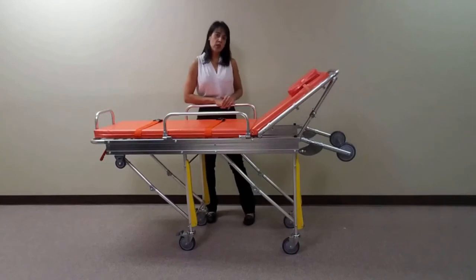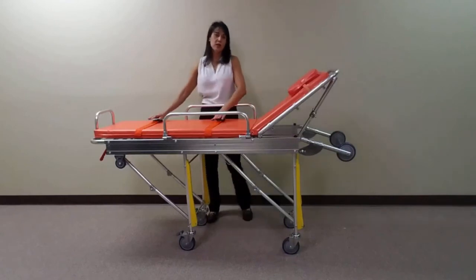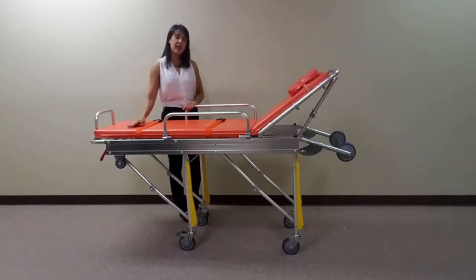For safety considerations, the unit comes with two drop-down locking side rails as well as two safety patient straps. This unit measures 35 inches to the top of the pad in a full upright position and 11 inches to the top of the pad when fully collapsed.